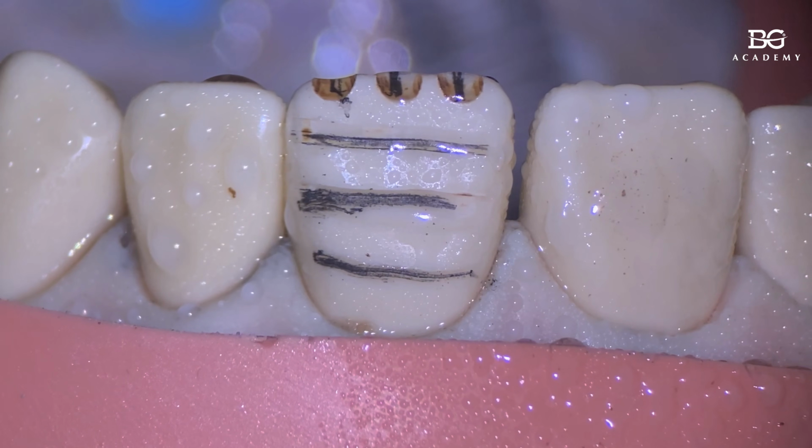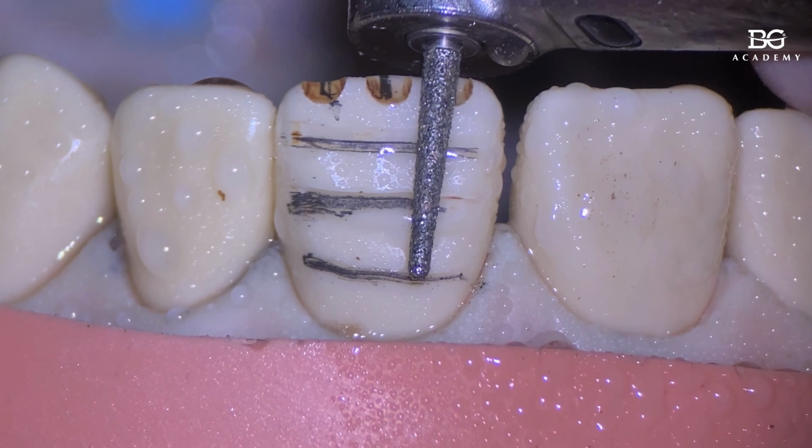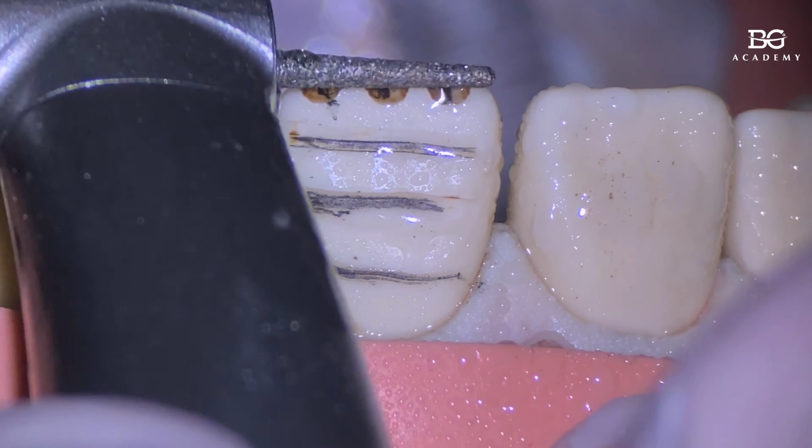Let's go. A few tips to control your planes, especially for people without great clinical prep experience. After we make the grooves, we take this tapered bur, in our case it's a 0.16, and I start to prep the surface. First I will reduce the incisal edge.